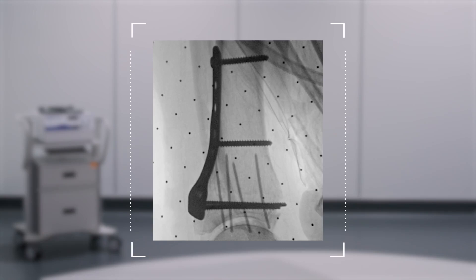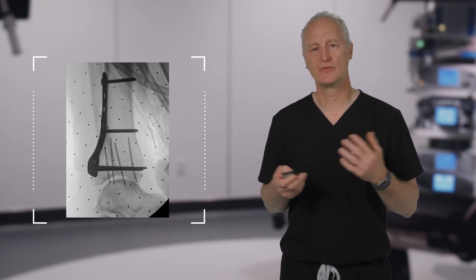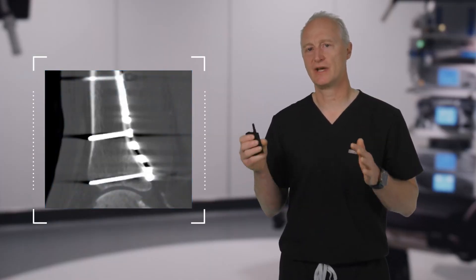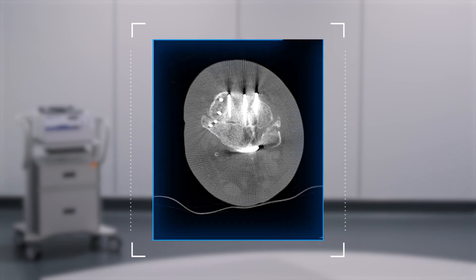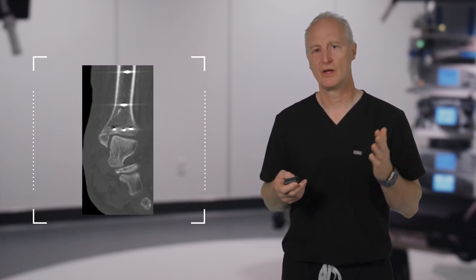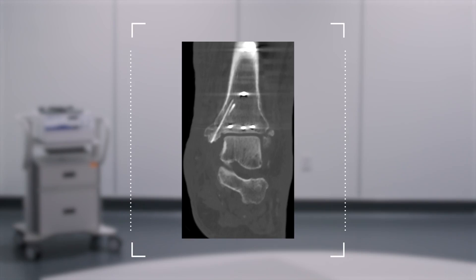You can see here the use of the fully threaded compression pins instead of what I would typically use in this situation — a small T-plate and multiple 2.4 or 2.7 screws. That technique was precluded by the patient's soft tissue envelope, which is compromised both medially and laterally. We've achieved an anatomic restoration of the medial malleolus, addressing the multiple fractures with the fully threaded compression pins as evidenced by the intraoperative radiographs. This is confirmed with a postoperative CT at about three to four months, which confirms anatomic restoration of the distal tibia with maintenance of reduction of the posterior malleolus fragment and medial malleolus fragments — the pins provided not only initial stability but long-term stability, leading to uneventful healing of this patient's complicated distal tibia fracture, confirmed by CT scan cuts through the articular surface.